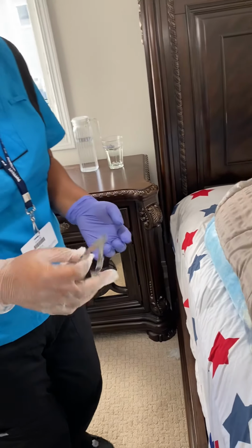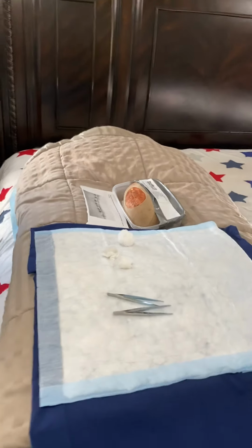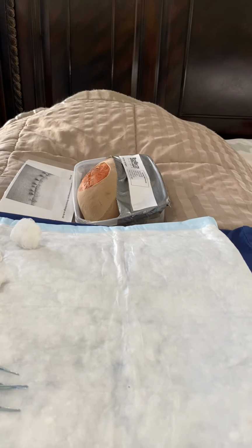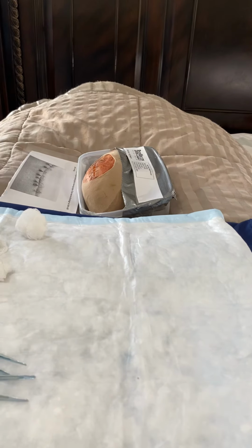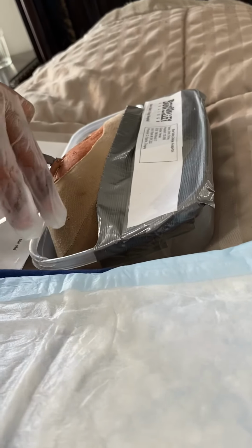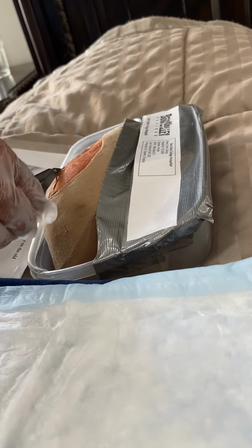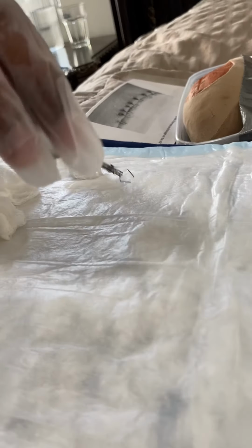Now there are, as I already told, 8 staples. So for practice purposes, I have to remove 3 alternate staples, not the first and last. So I take the second one from the inner side, and gently remove the staple and put it on the side.